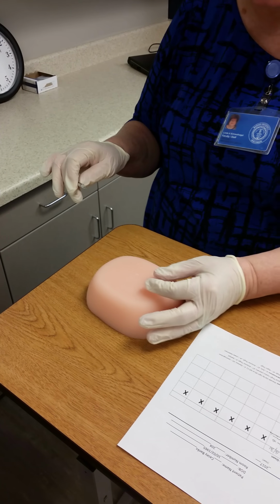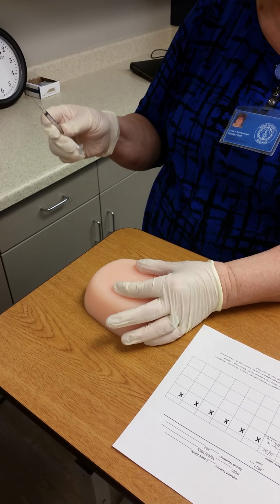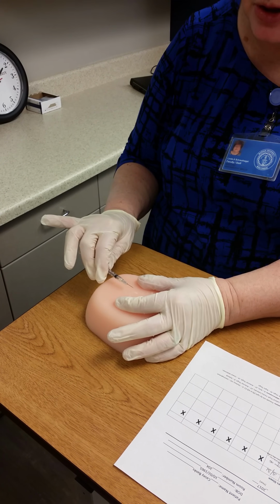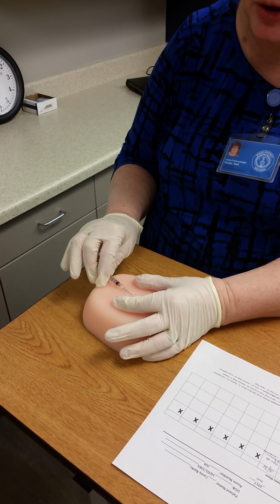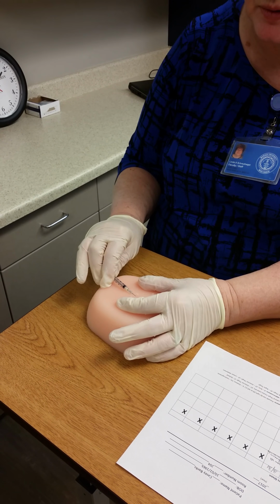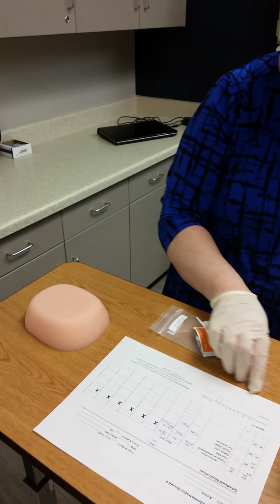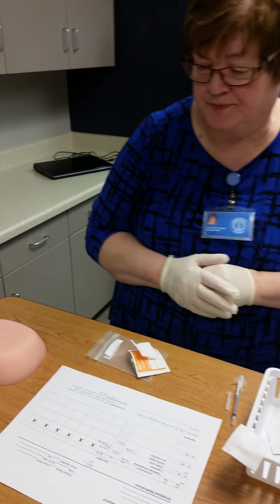Or you can come in a little bit farther apart, spread your skin taut. You're going to bevel up, finger off the plunger, come in your 1/8 inch, and then use your little finger, if your fingers are big enough, just to move that fluid in. Wait a second or two, and then pull out your needle and release. Okay? You are going to give the equipment to the instructor. She will recap your needle for you.